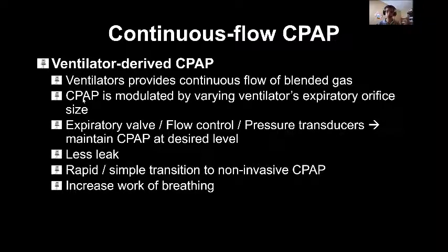And the pressure of the CPAP from the ventilator is modulated by the expiratory valve at the expiratory port of the ventilator. Of course, some machines have a valve that controls itself, how much in and how much out. It's exactly the same as the injector that we use in new cars: when you press more on the fuel pedal, you get more opening and more fuel going to the engine, faster and faster. The exhalation valve of a new machine has a control system. The more pressure you need, the more the valve closes. The less pressure you need, the less it closes. So it can modulate itself. That's the newer type, but some of them don't have it. This will determine the price of the machine.